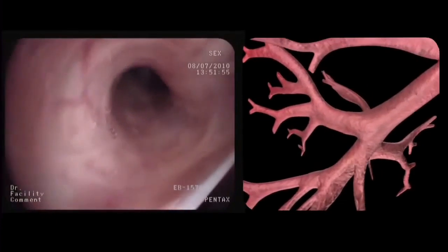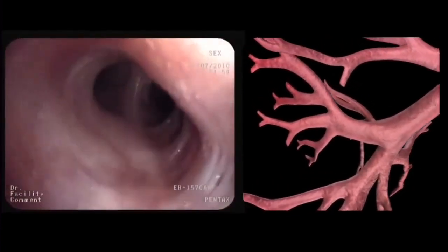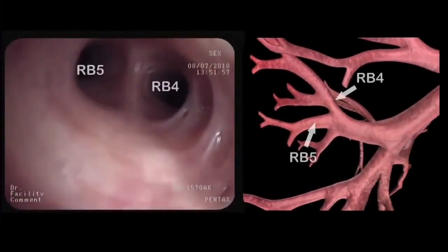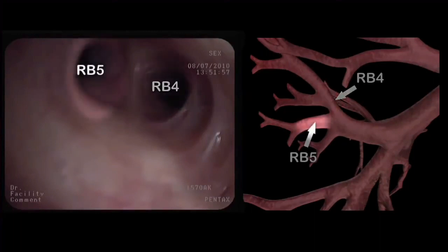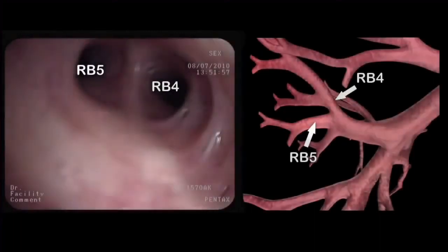We then enter the middle lobe bronchus, which divides into the lateral segmental bronchus or RB4 and the medial segmental bronchus or RB5.